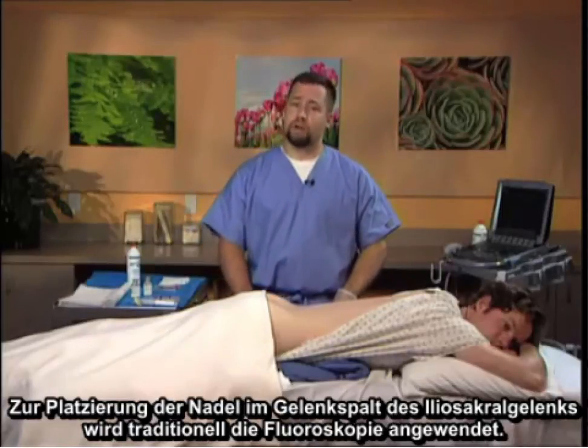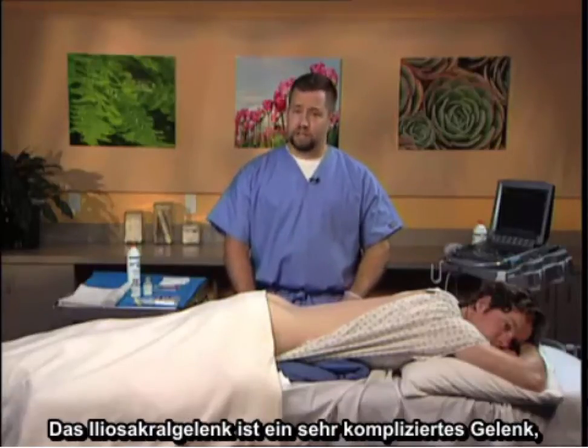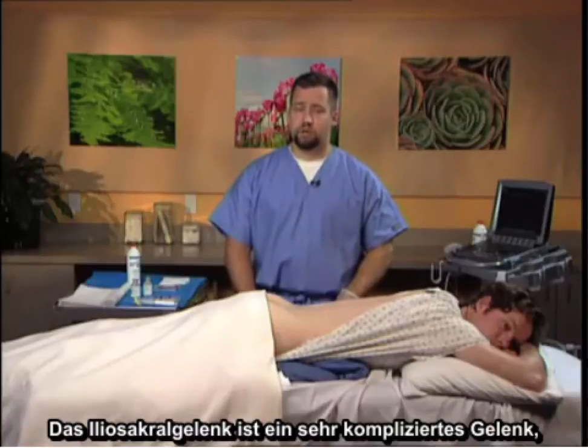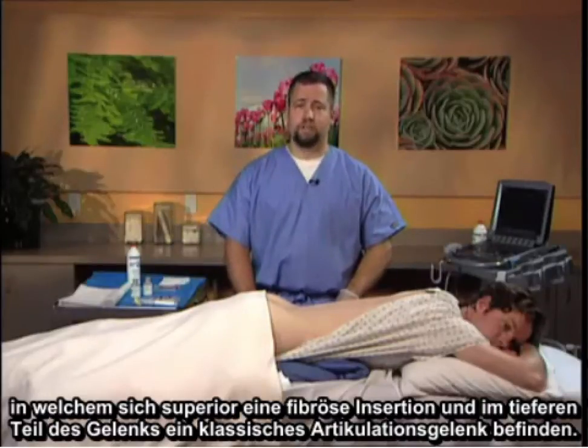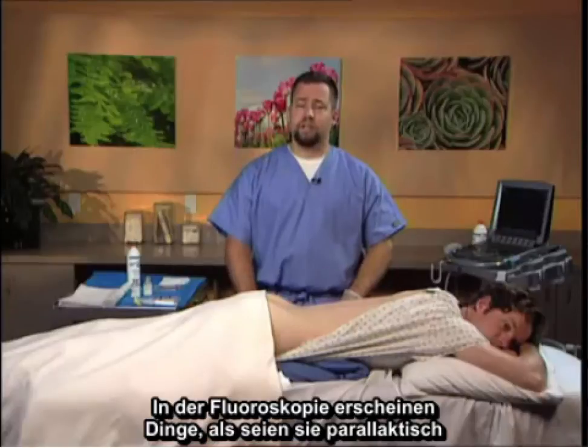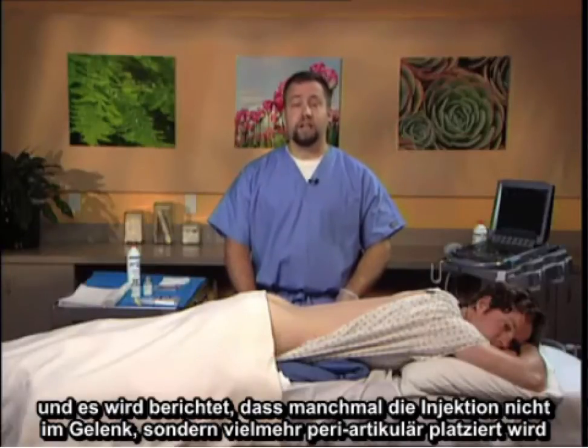Traditionally, fluoroscopy is utilized to place the needle within the sacroiliac joint space. The sacroiliac joint is a very complicated joint in that it is a fibrous insertion superiorly and a traditional articulating joint in the lower portion. On fluoroscopy, issues arise such as parallax, and it is well documented that sometimes the injection is not placed within the joint but rather periarticularly.